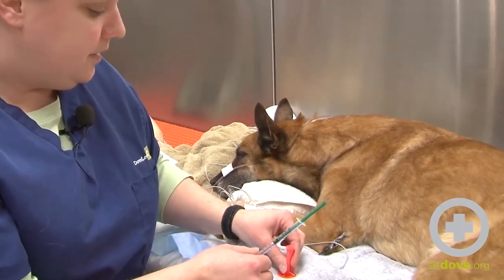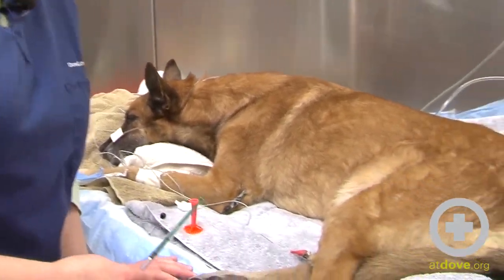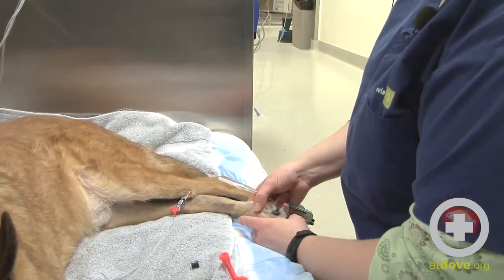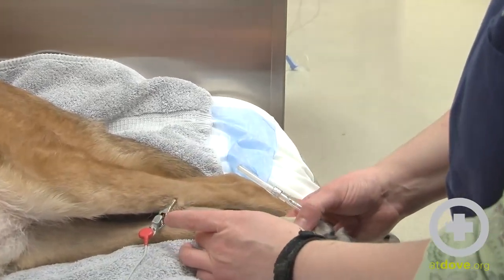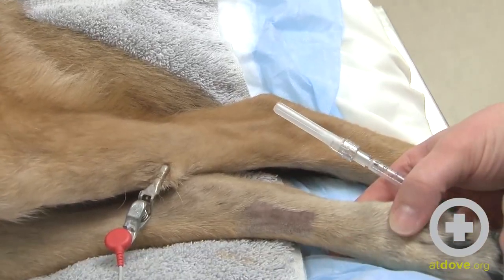Getting a sample from the dorsal pedal artery is probably the easiest way to do it in a dog. It's on the medial side of the foot, distal to the hock. I've shaved an area and just wiped it with some alcohol to clean any debris off his skin.